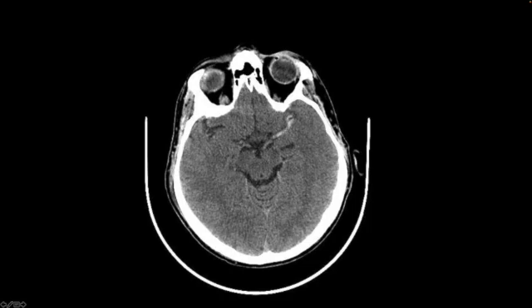The blood here is actually even more dense than the blood pool within the dural venous structures that we can see. So this is an abnormally hyperdense MCA, which suggests that there's clot in this vessel — one of the very earliest signs of an acute infarct that we can see.